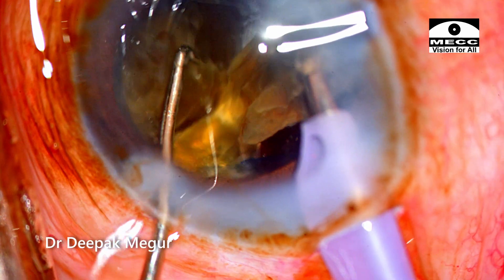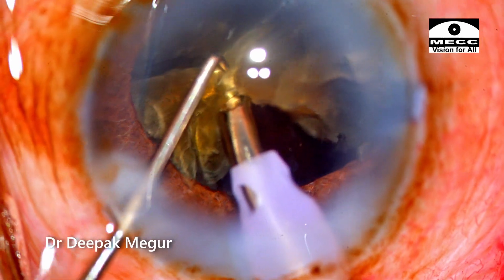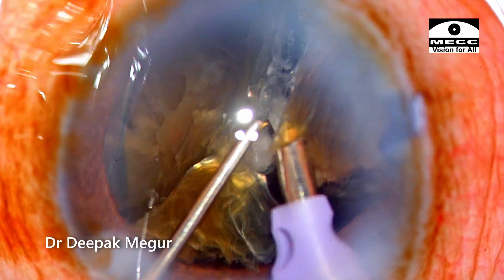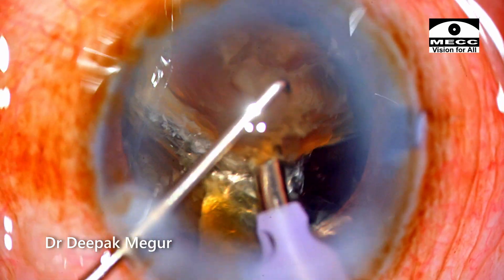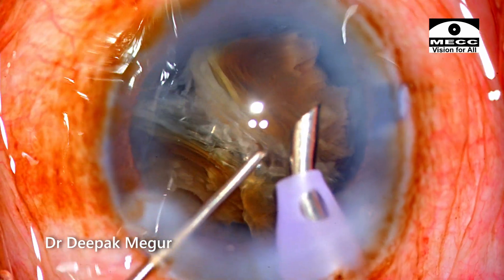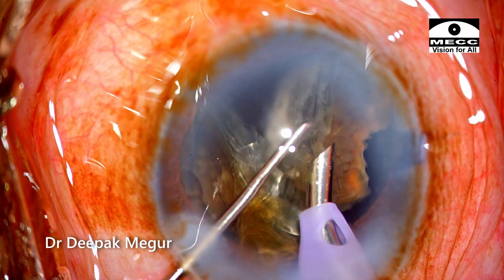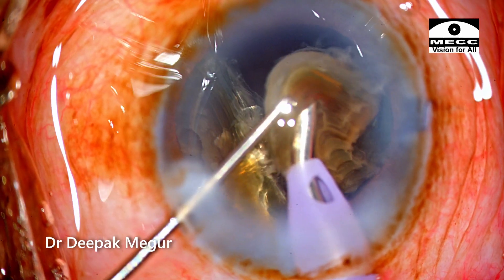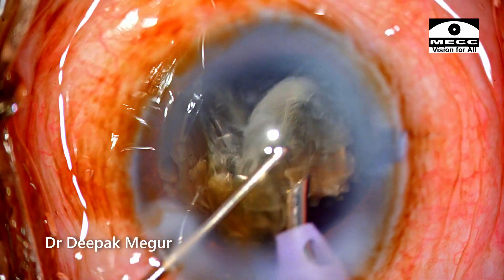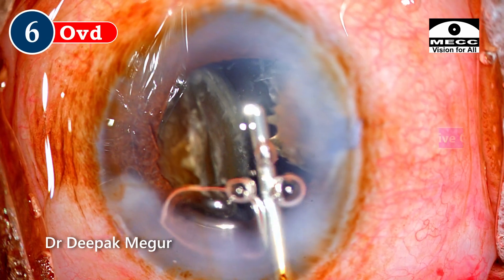These three pieces are being held by a common nodal point. I lift up these three pieces at the posterior attachments and then phaco that base area, which very easily separates the three fragments. However, each of these three fragments is still quite large.